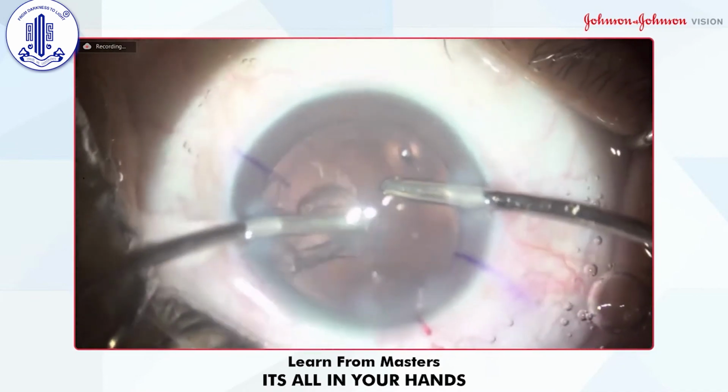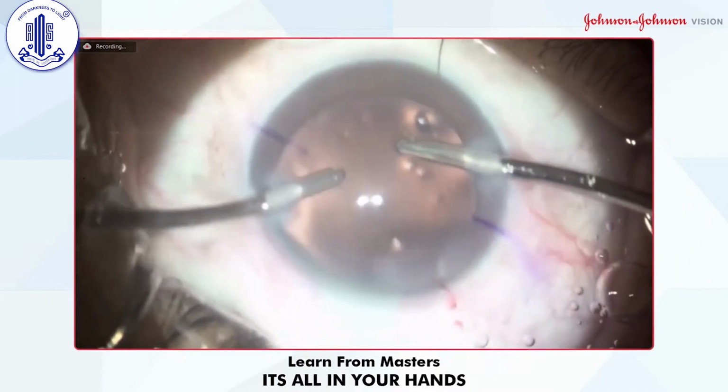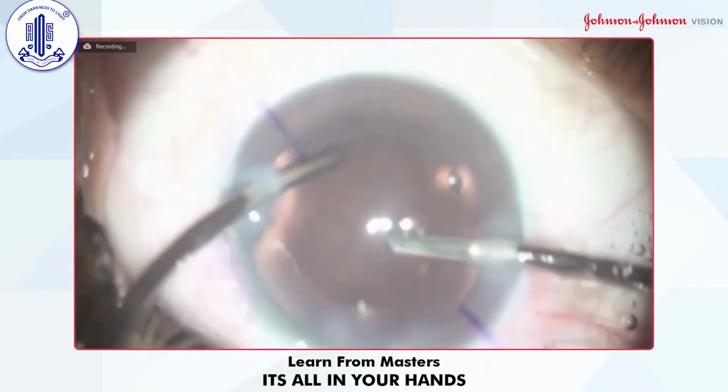So very simple step, as you know, the catch, pull and aspirate. Catch, pull and aspirate. This is the way. And then we go for the fine polishing of the posterior capsule. I think you can appreciate now.